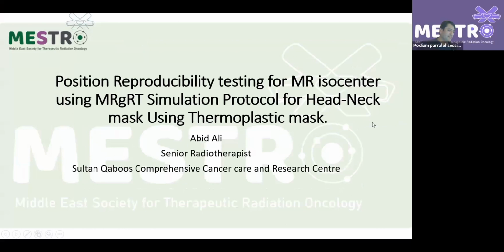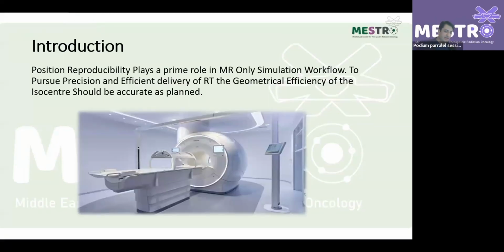The topic of his study was position reproducibility testing for MR isocenter using MR guided radiotherapy simulation protocols for head and neck by using the thermoplastic mask. This is the picture of the MR simulator which they are using at their center.